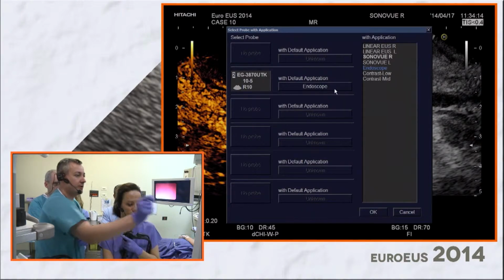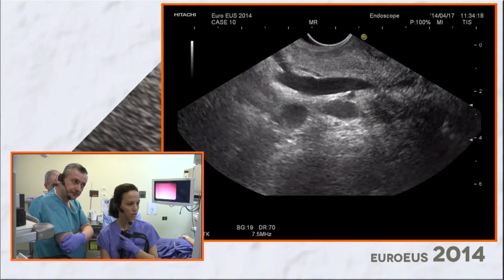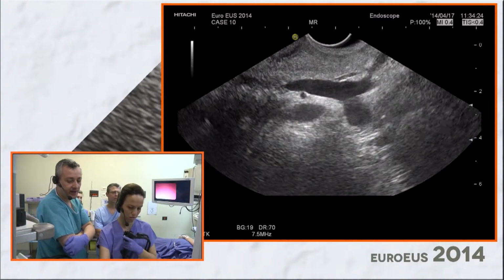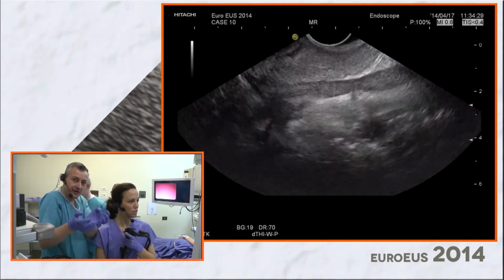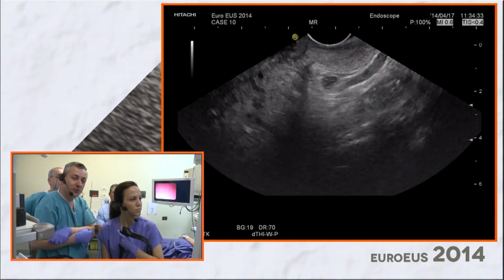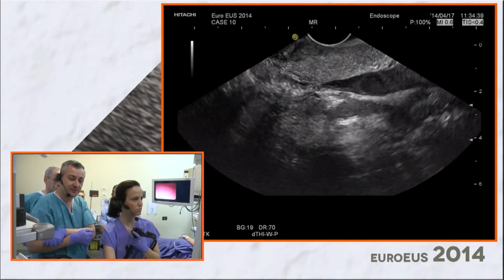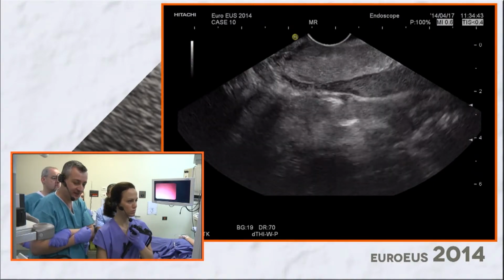you said it's typical for adenocarcinoma. You think it could not be a metastasis of the breast cancer? Well, that's of course a discussion. Metastases can have similar aspects, but usually they have a peripheric vasculature. So of course we will still need the FNA results, but at least we know it's a malignant lesion, so we know that for sure it's not benign.